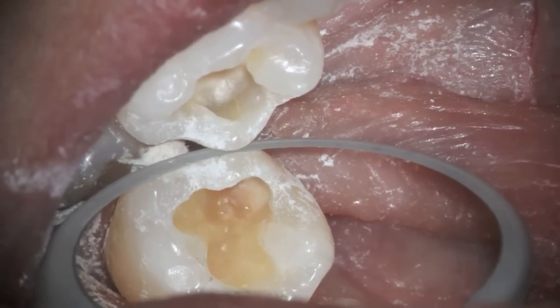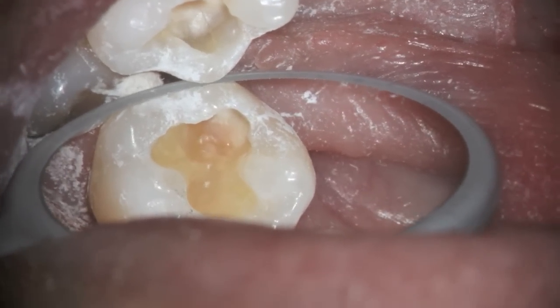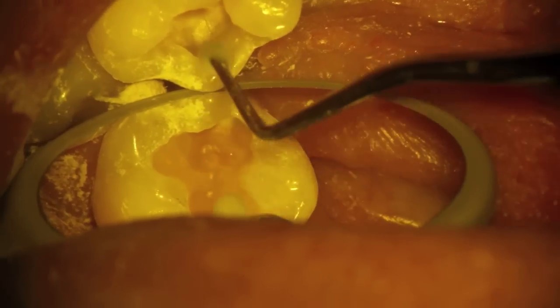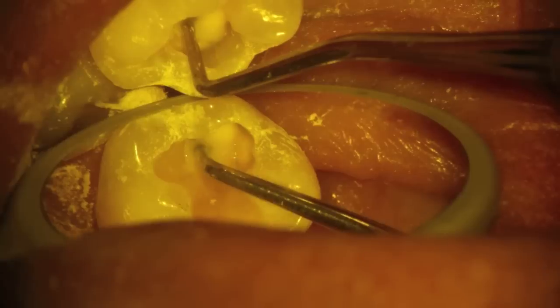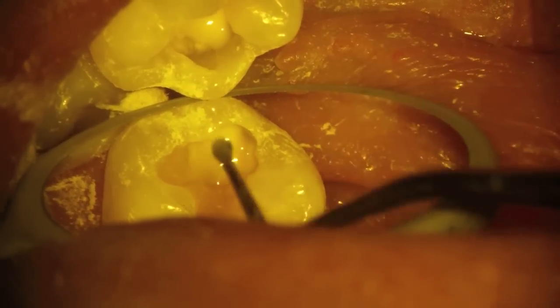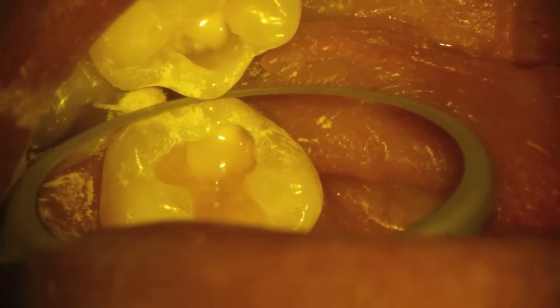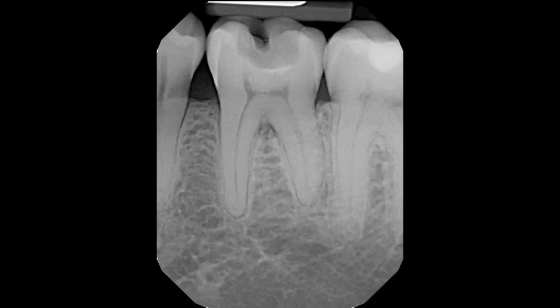From up on top it doesn't look all that bad, but you can see the cusp is undermined where the stress fracture is. Here's the base that we're placing — someone would be tempted to just leave it this way, but over time there's a pretty good chance the person is going to break that tooth, assuming they have normal occlusion. So we take an x-ray and you can see how close we are to the nerve. This x-ray shows the actual base layer, and we also take a periapical x-ray to make sure the nerve is doing okay — presently it is.